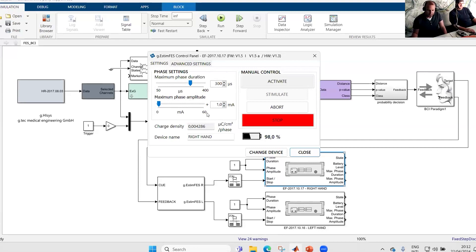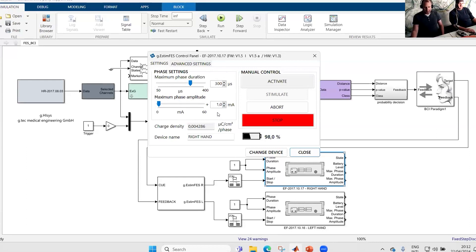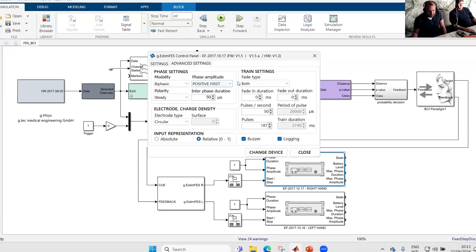Some people need more current — for example, patients who have had a stroke often need quite high intensity. Healthy people usually don't need such high stimulation currents. Other settings are on the second panel: you can activate different path lengths, fade-in duration, fade-out duration values. We can also see battery level status — the device is battery driven.